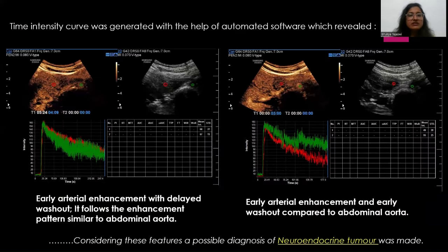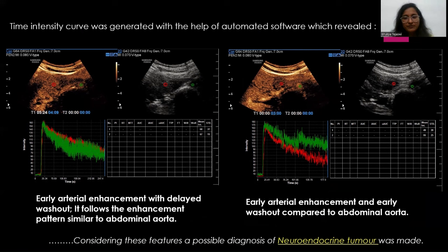A time intensity curve was generated using automated software, which showed early arterial enhancement with delayed washout for the primary lesion, following an enhancement pattern similar to the abdominal aorta. The adjacent metastatic nodes showed early arterial enhancement and early washout compared to the abdominal aorta. Considering these features, a possible diagnosis of neuroendocrine tumor was made.